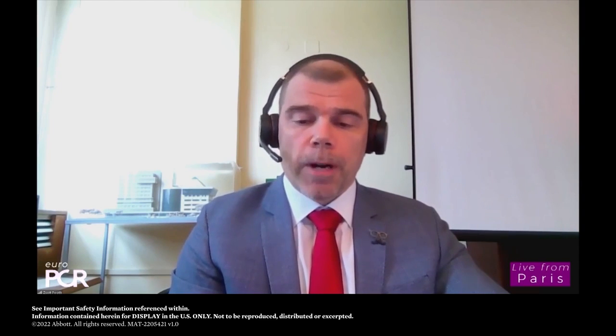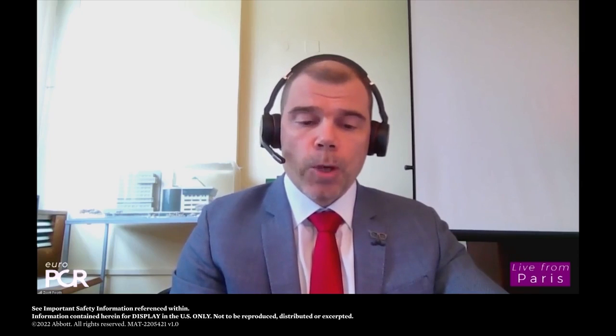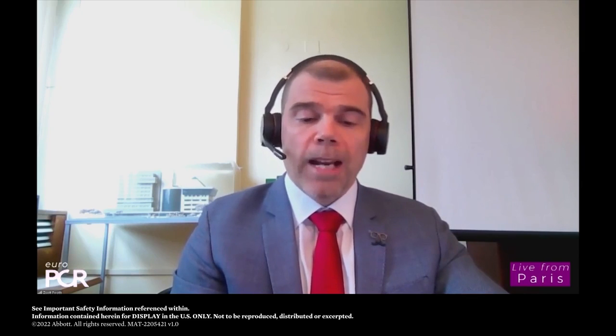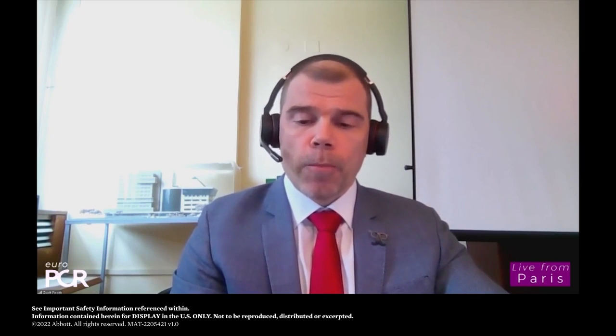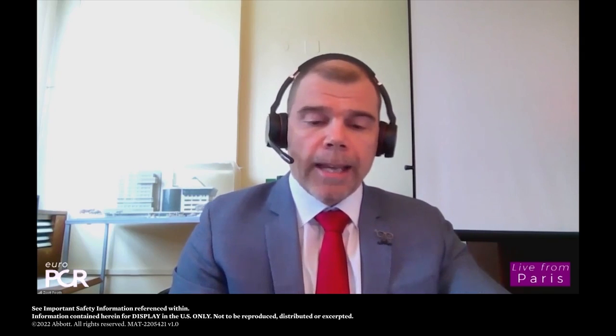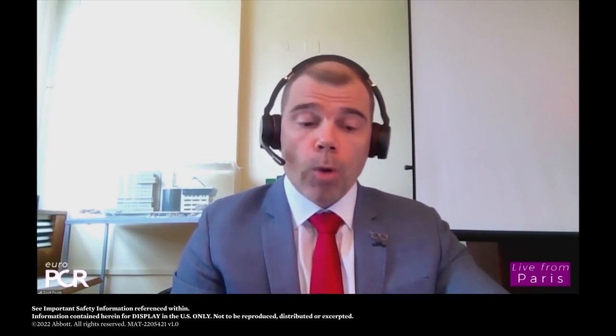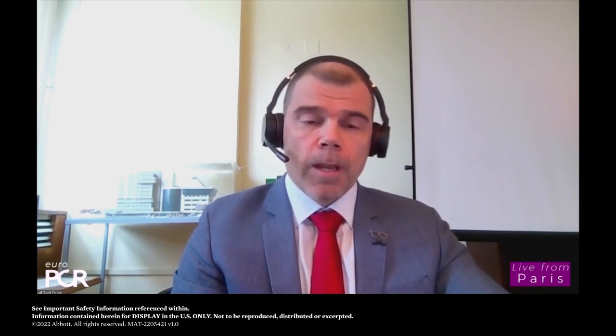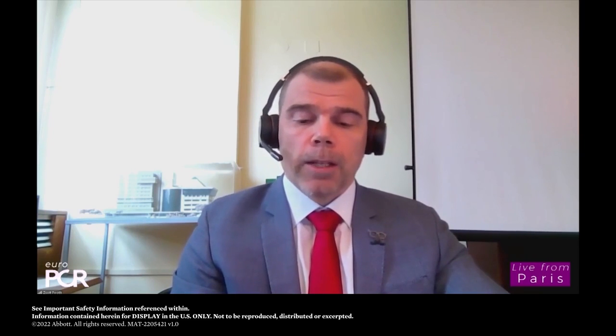First, we will see the diagnostic part of the case, followed by 5 minutes of Q&A, then a lecture by Dr. Tomaso Gori with the title, Sending a Patient Home Confidently, the Prognostic Value of Post-PCI FFR and/or an Optimal OCT Result, again followed by live discussions triggered not only by the questions of the panel, but also those of the audience, communicated by the chat master. And finally, we will be shown the treatment part and the post-PCI evaluation of the case. Without further ado, I would like to ask my colleagues in the studio to show the case.